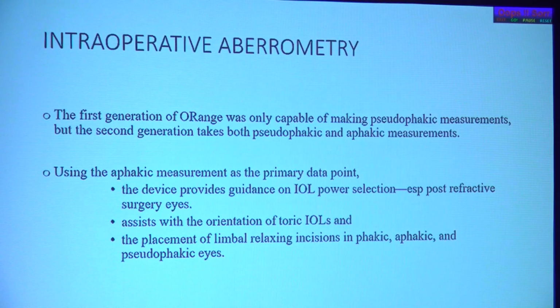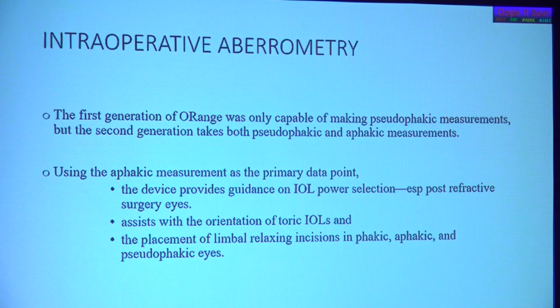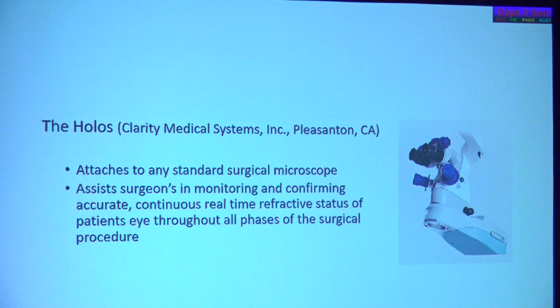Intraoperatively, you can refine the IOL power and then implant, so that the IOL power is perfectly calculated for the patient, and also for the orientation of toric IOLs in a post-refractive surgery eye. And this is the Holos, the most advanced one. The advantage is that it monitors and confirms accuracy throughout the procedure. It's a real-time imaging of the eye.